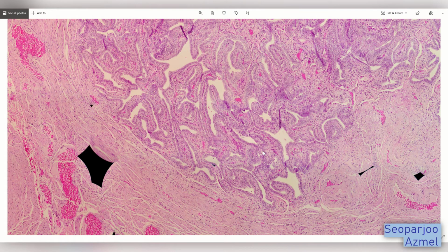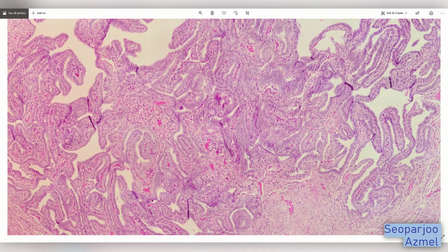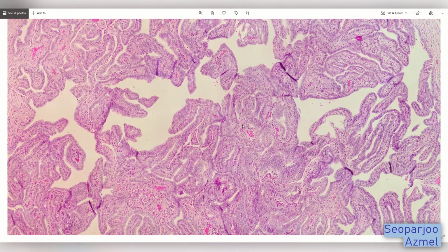You can use these images in teaching all sorts of things, including anatomy, anything that uses a microscope or has an eyepiece. For example, if you are in ophthalmology, you use that eyepiece to capture images of the retina. You can also use this method.